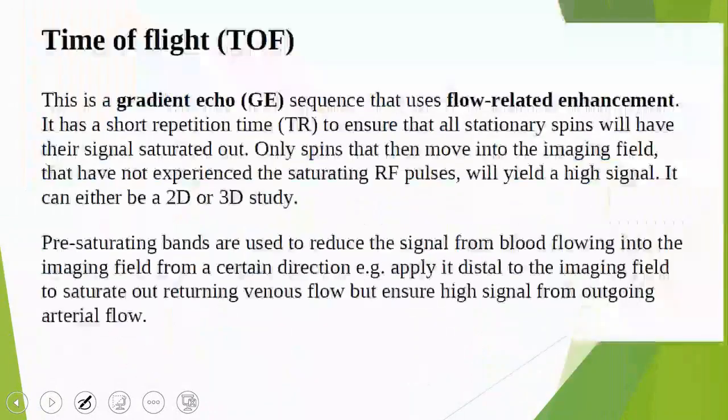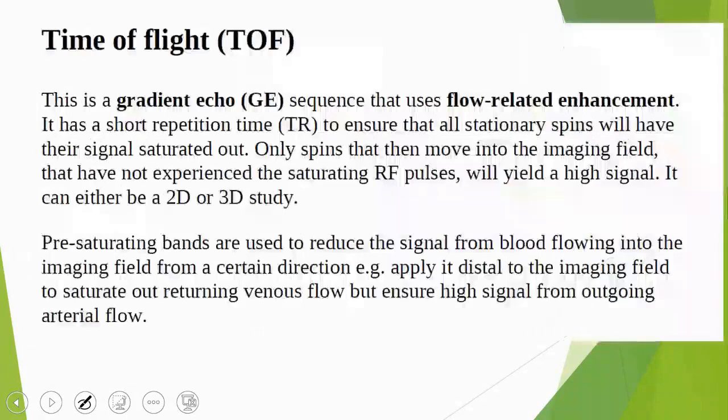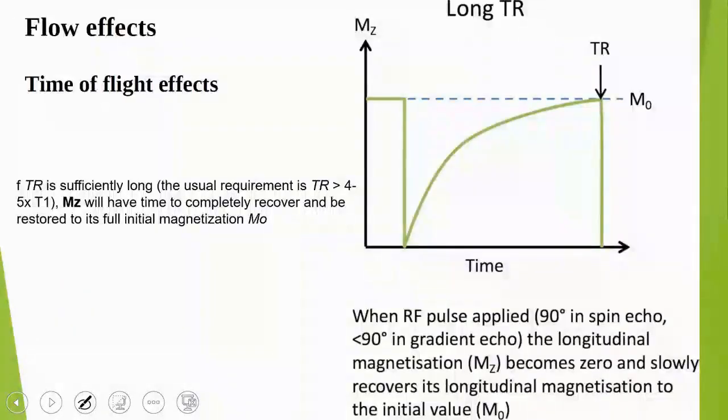Now, let's talk about the time of flight. Fast or slow flow, okay, but I want to make the arteries light up in the visualization, for example. So what do we want to think about doing? They said there is something called steady state. What does steady state mean?